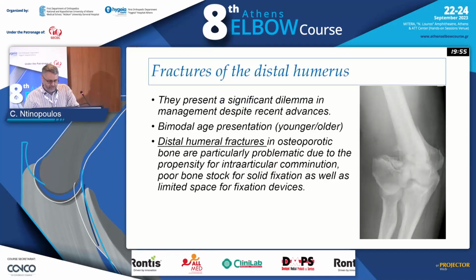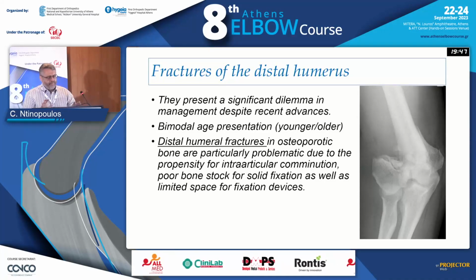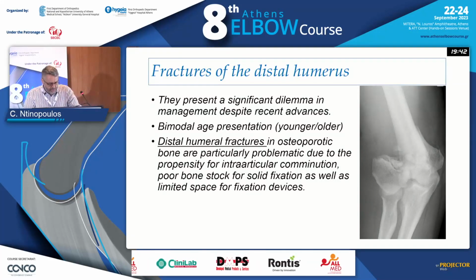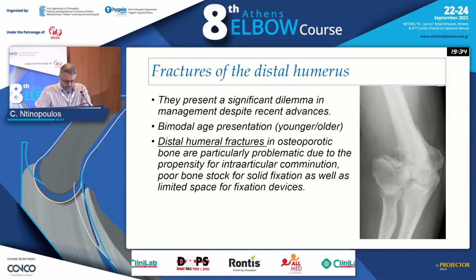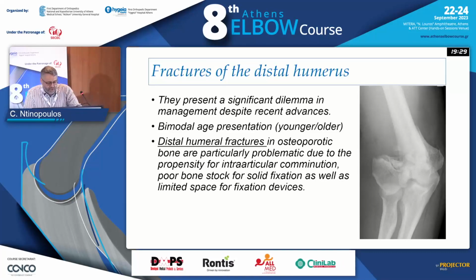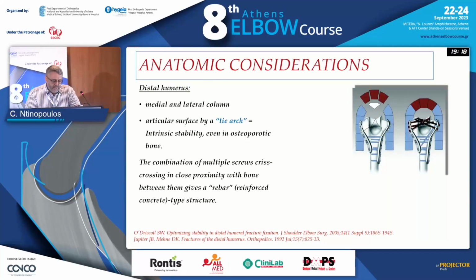Distal humerus fractures present a significant dilemma in management, despite recent advances. They have a bimodal demographic presentation: in the high-energy younger population and in the elderly osteoporotic population. The problem is the comminution and the osteoporotic bone, where the intra-articular comminution creates poor bone stock for solid fixation and limited space for fixation devices.